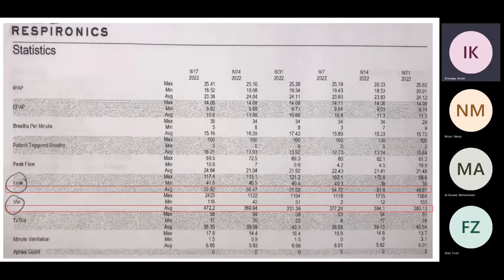So after I look at the tidal volume, the next thing I look at is the leak before I change anything. I told you in the history, full face mask, right? Look here, average more than 40, 50, or above 40, 60, 50. So there's something wrong with the mask, right? There's at least some leak. I'm not saying that this is the reason, but if this one is fine, maybe the patient should not have reached the pressure support maximum all the time, but it's reaching it because I think it's inappropriate. Some of the volume is out. Yeah, right. Next.